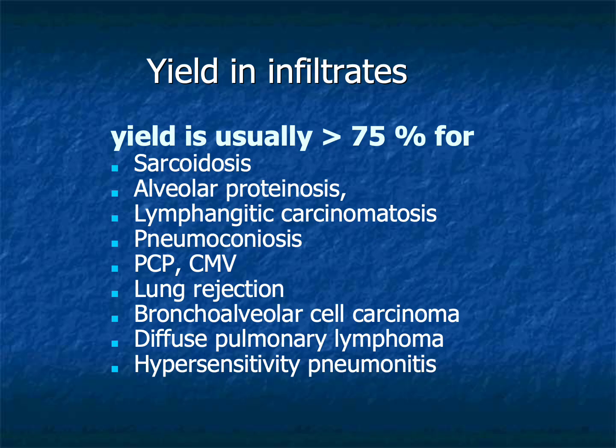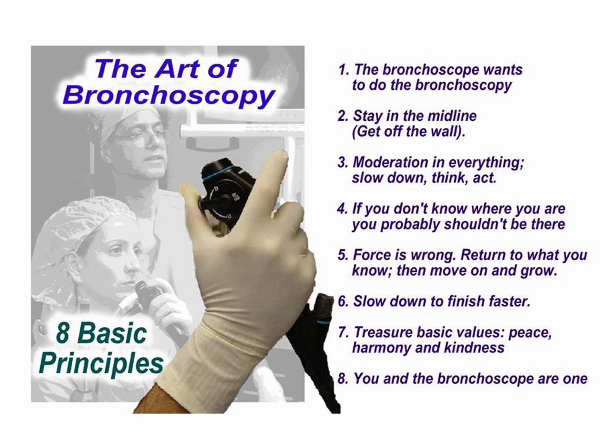In summary, transbronchial lung biopsy has evolved from a high-risk hospital procedure into a routine diagnostic technique performed safely in modern bronchoscopy suites. Its success depends on thoughtful patient selection, appropriate indications, familiarity with equipment, meticulous technique, and recognition of potential complications.